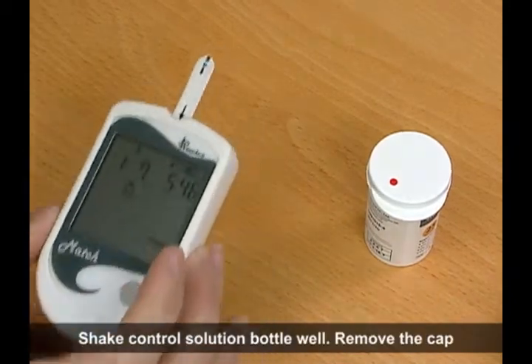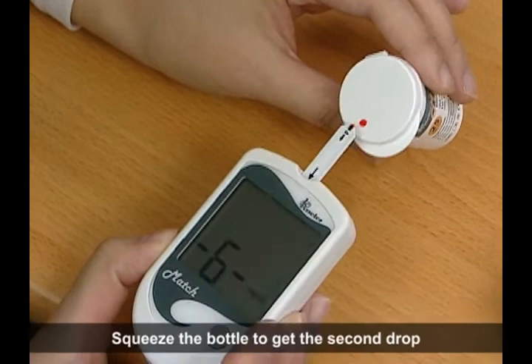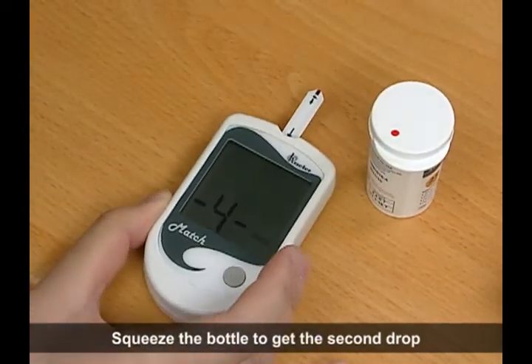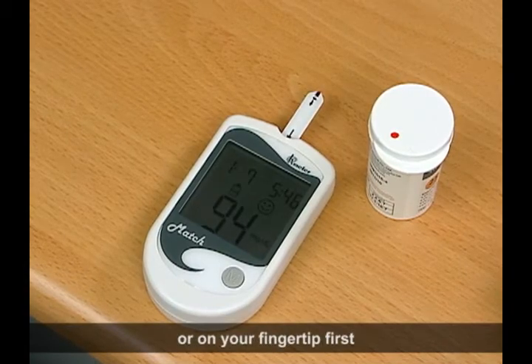Shake the control solution bottle well. Remove the cap. Squeeze the bottle to get the second drop onto a clean non-absorbent surface or on your fingertip first.